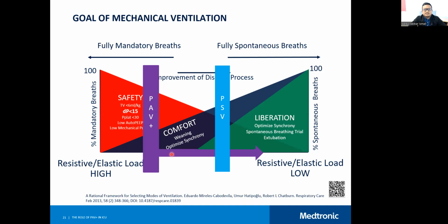It's quite safe and comfortable for the patient, actually better synchrony, and you can use it throughout until the patient is extubated. Okay, it might take a few days, but you can use it throughout the rest of the mechanical ventilation days.